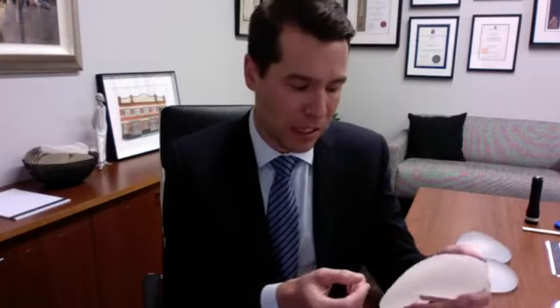His research to date has indicated that texturing of implant surfaces is associated with ALCL. He's managed to, with his team, determine which textured surfaces have got a higher risk compared to others. And so the immediate answer to are all textured implants bad is no. We know that macro textured implants have got a higher risk of developing ALCL than other implants on the market. The macro textured implants include the Biocell implant, which was in widespread use for many years. Allergan produced this and have just recently issued a worldwide recall or ban on its use. So we as plastic surgeons are not able to use this implant anymore.